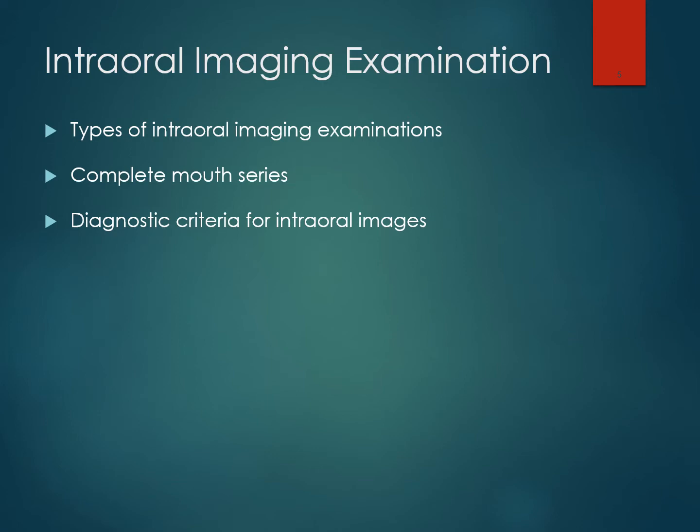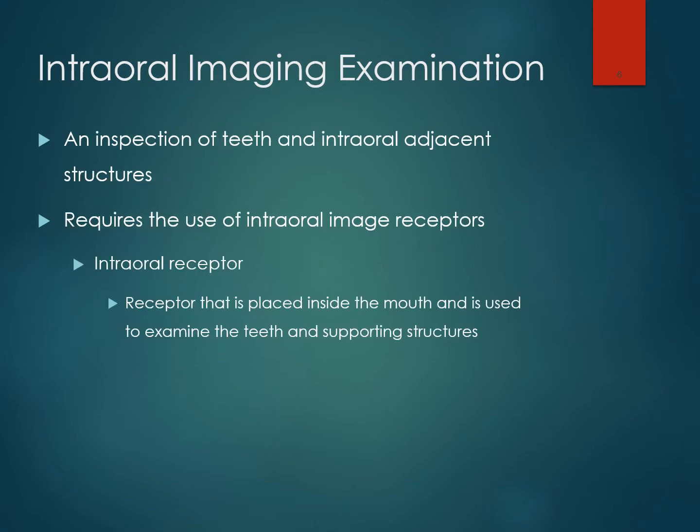Intraoral examinations are the foundation of dental imaging. These are what people think of when we think about taking dental x-rays. For intraoral imaging, we are doing an inspection of the teeth and the intraoral adjacent structures. So we're looking at the bone, we're looking at the roots of the teeth, we're looking at maybe the sinus, we're looking at any of those nutrient canals. We're looking at all of those kinds of things when we look at intraoral imaging examinations.